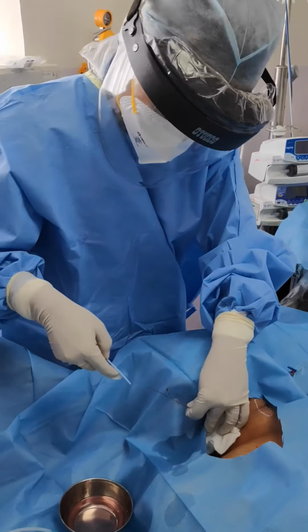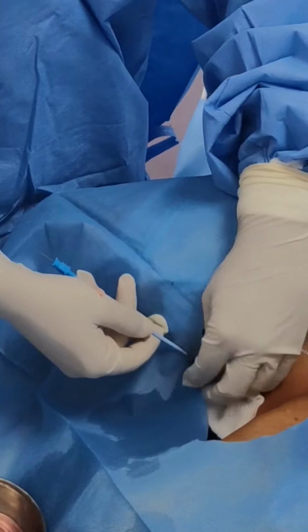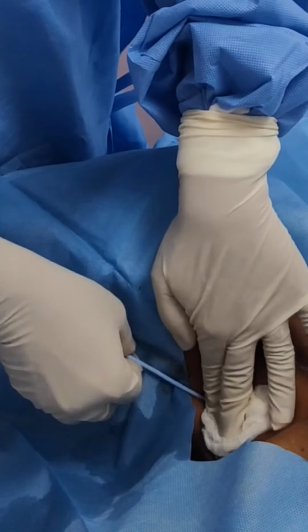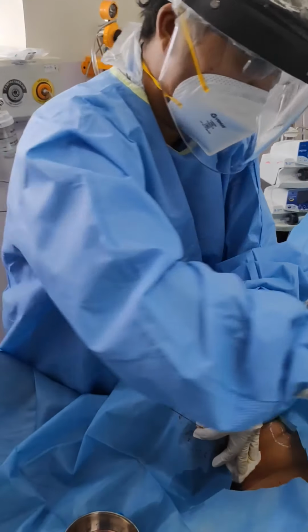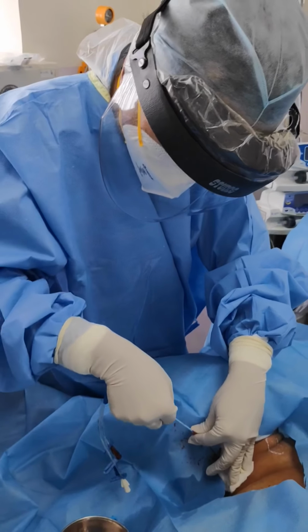Now I'll be dilating the tissue with the tissue dilator. Putting in the central line itself.